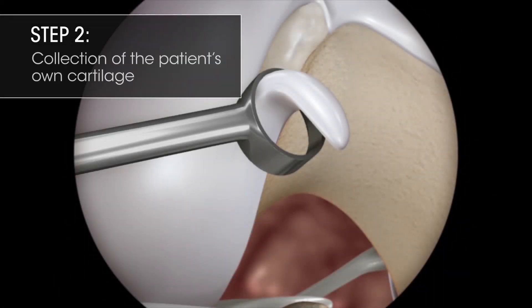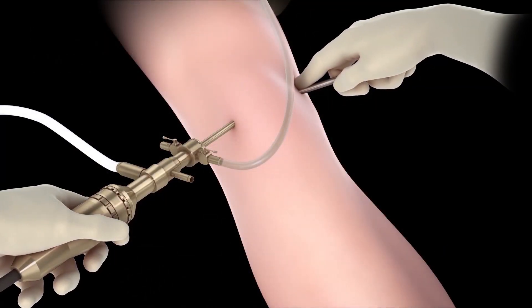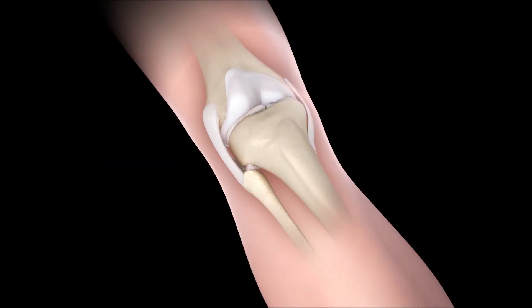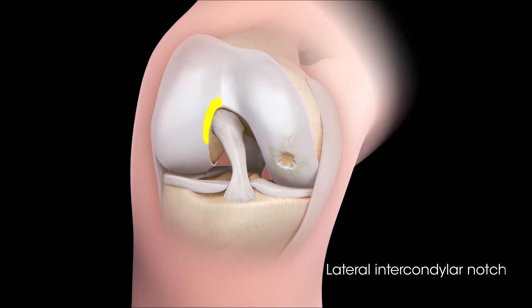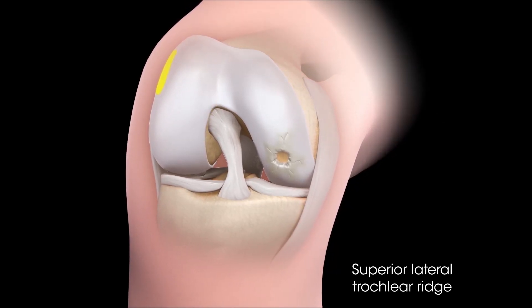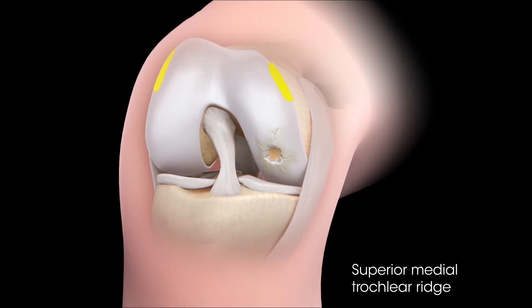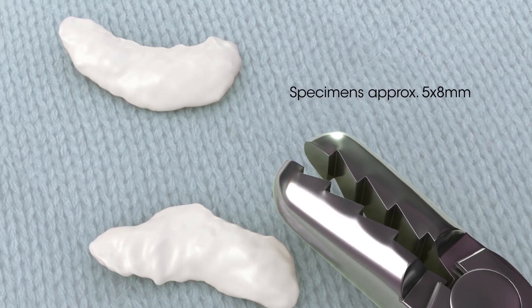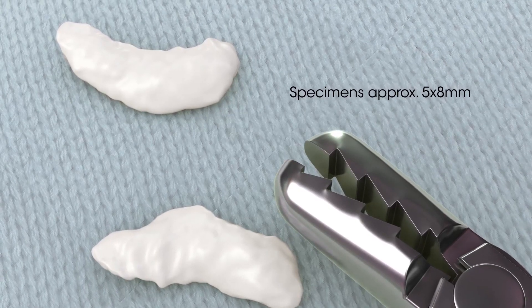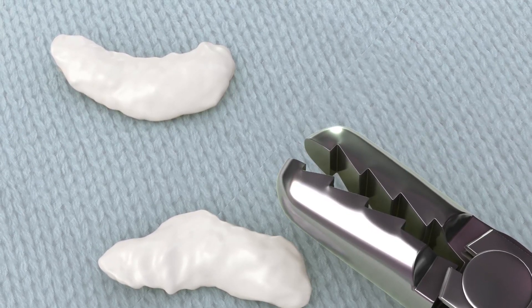Step 2: Collection of the Patient's Own Cartilage. When harvesting a biopsy, there are three non-load-bearing locations recommended: the lateral intercondylar notch, the superior lateral trochlear ridge, and the superior medial trochlear ridge. In all cases, two full-thickness specimens measuring approximately 5 x 8 mm are needed. Obtaining some bone with a biopsy is also recommended.